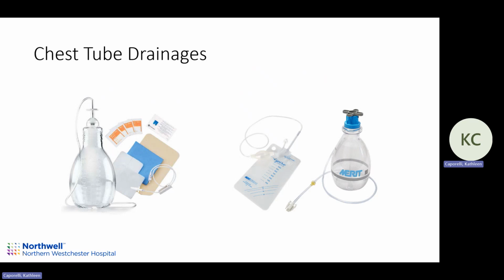I had actually first time using it on Monday. This basically is a drainage bag, and you hook that up to the Aspira catheter. There's a little hand pump that you pump, and you can just drop the bag on the floor, and it'll help suck out. I guess there's also a bottle system that's pretty similar to the Pleurex.